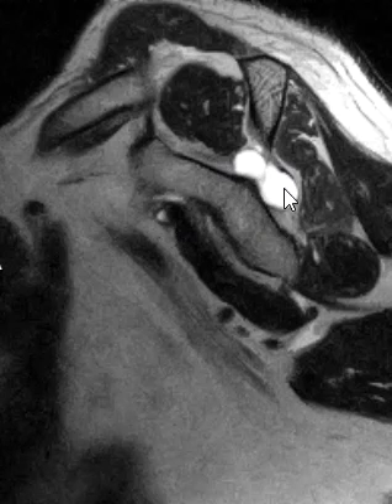So the suprascapular nerve is getting pinched — the division that goes to the infraspinatus — causing a little bit of infraspinatus muscle edema and atrophy. Depending on where the nerve is pinched, you may also get supraspinatus muscle atrophy. A lot of times I see them together, but this one is in the right position to affect just the nerve going to the infraspinatus. Thank you very much.